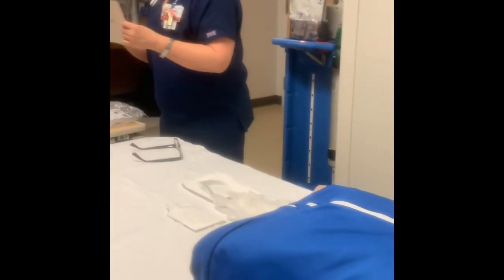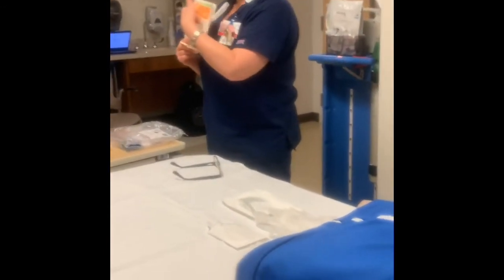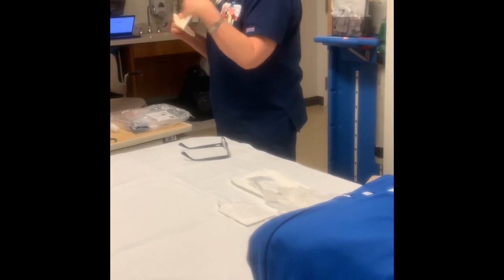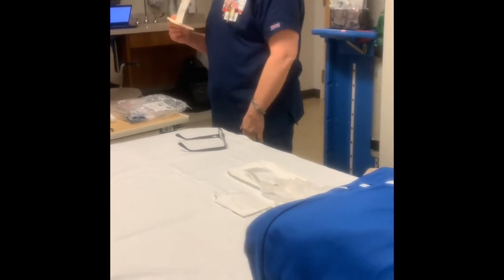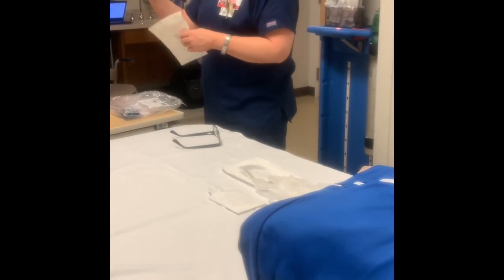I bet they're comfortable. Much more comfortable, and like I said, the company tells you right here exactly the use, one-time use, obviously. They're sterile, but they don't need to be because this isn't sterile, the trays aren't sterile. But the other thing is they can stay in for 7 days, mildly absorptive. And the color side goes up. Color side goes up? Yes, color side goes up.